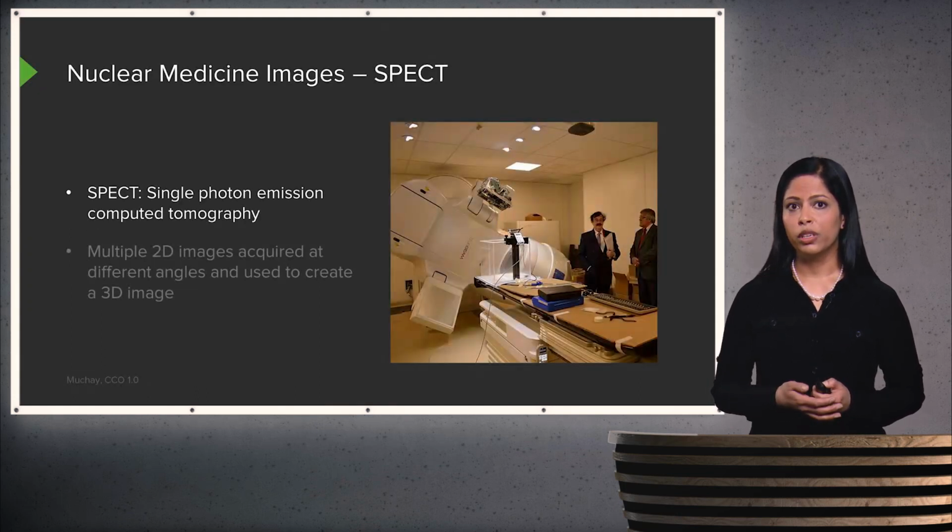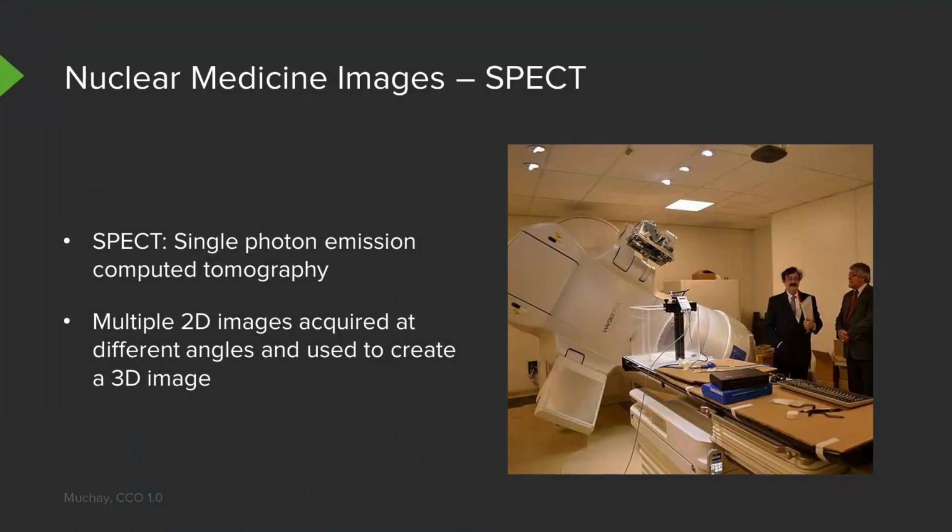SPECT is a type of nuclear medicine examination, and that stands for Single Photon Emission Computed Tomography. It means that multiple 2D images are acquired at different angles, and they're used to create a 3D picture.